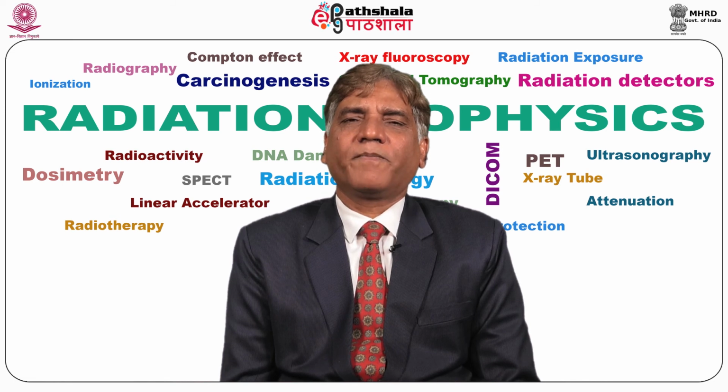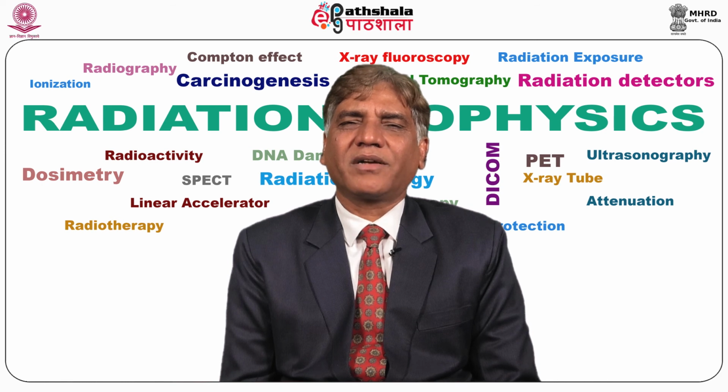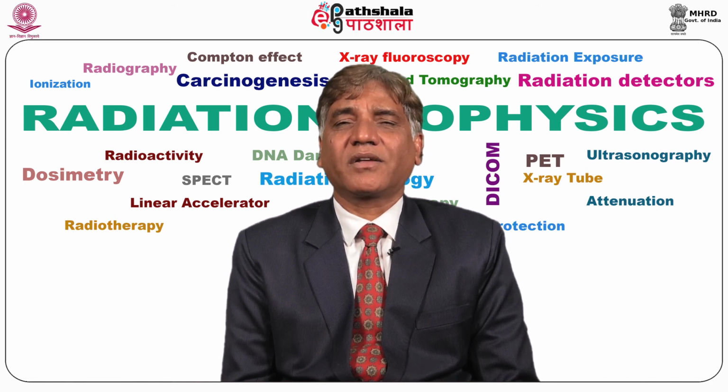When the ultrasound beam interacts with the body tissues, a portion of the ultrasound beam is reflected in the form of echoes, and these echoes are utilized to reconstruct the image in ultrasonography.